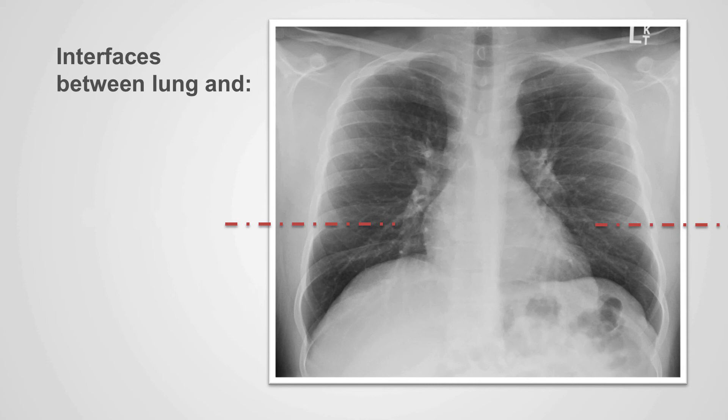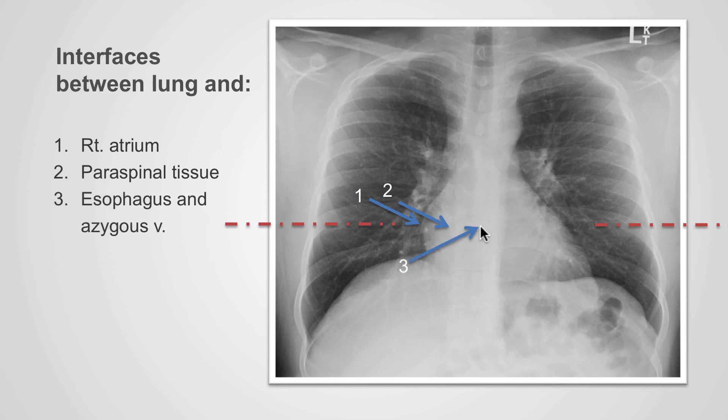Can you identify what would cause the interface between the lung and here? That is the right atrium. We can see another interface in this region and that is caused by the paraspinal tissues. There is another interface at this level. Do you know what that is caused by? That is caused by the interface between the lung and the esophagus and the azygos vein.